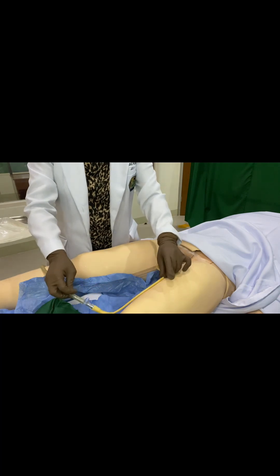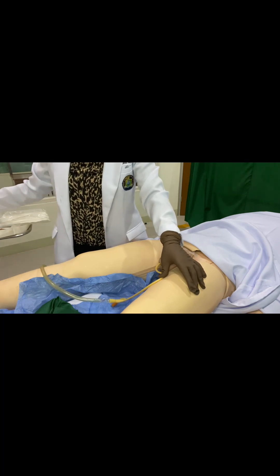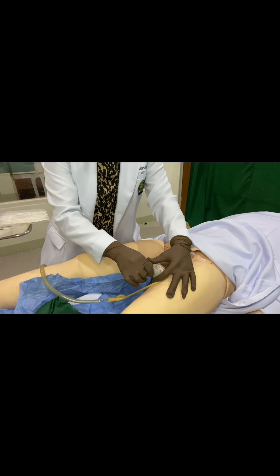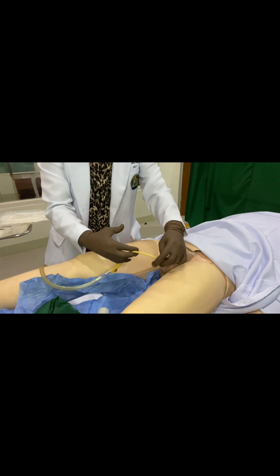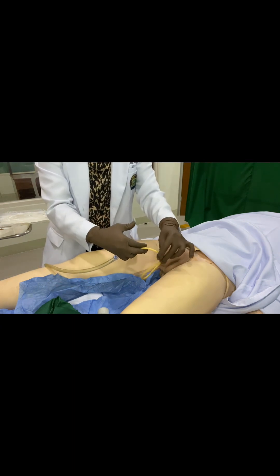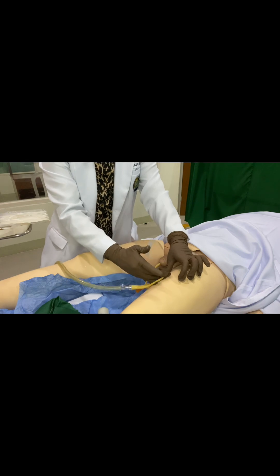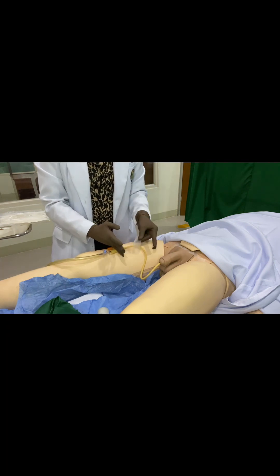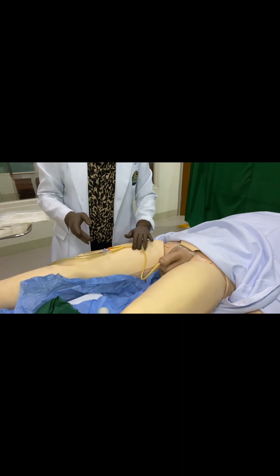Apply microtape to the leg to prevent accidental removal or pulling of the tube. Give a space between the penis and the leg so that in the morning, if there is an erection, there is room to accommodate it. Tape to secure the Foley catheter in place.